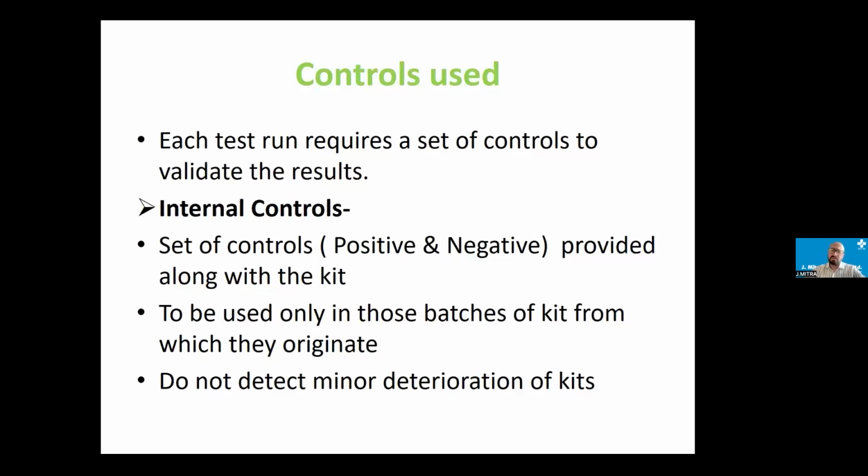What is the proportion that you're getting in this? Since CLIA is extremely different from the rest of the ELISA and rapids, in our general sample population, how many such cases are coming as false positive? Or is there any specific test that is coming more positive as compared to the others, whether it's HIV, hepatitis C, or hepatitis B? Any such data that you work with, and you can share with the audience?